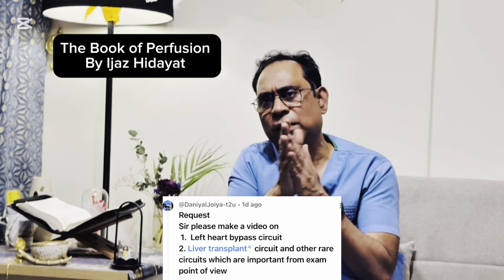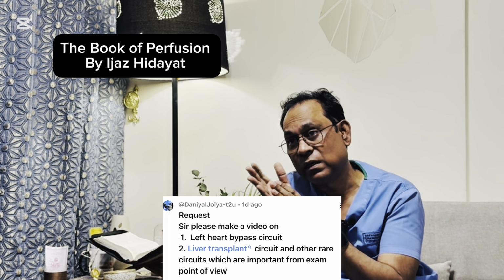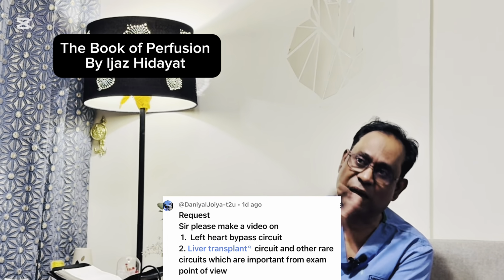So, yes, the left heart bypass circuit. Today I'm going to explain what left heart bypass is and what is different between left heart bypass and conventional cardiopulmonary bypass. Usually in left heart bypass we take blood from the left heart and return it into the descending aorta. So we are bypassing the function of the left ventricle through this left heart bypass mechanism.